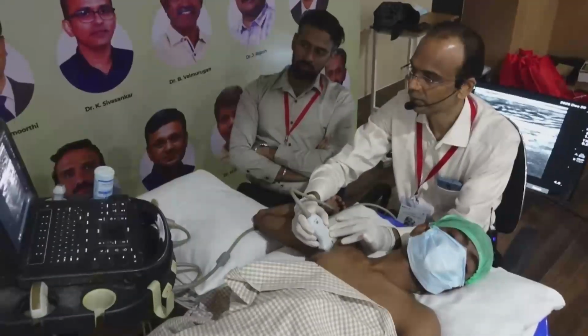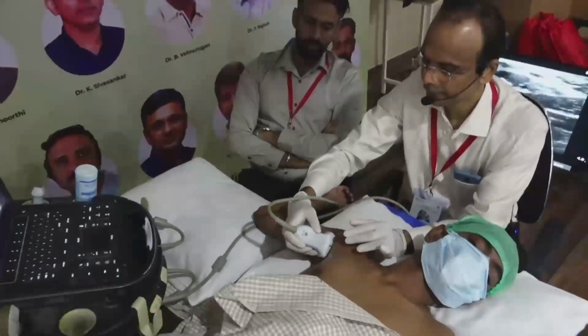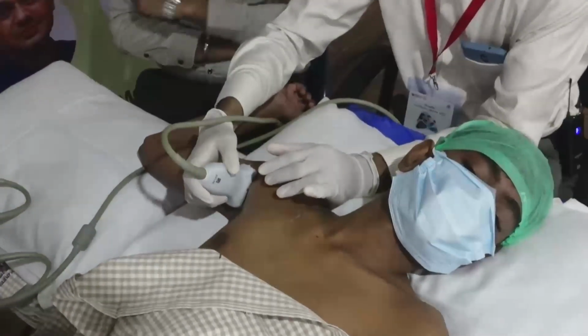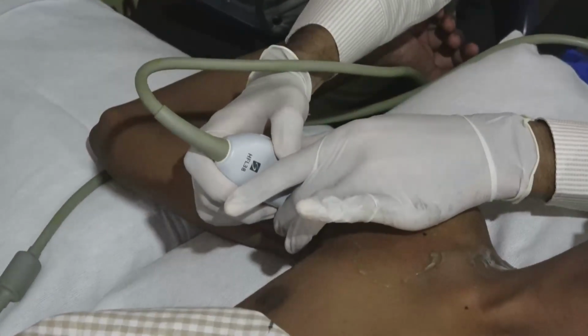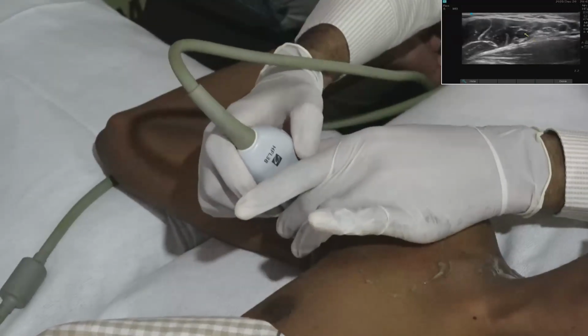The cords, we are following along with the vessels. Now we have to look for the axillary vessels. So depth we can reduce. You can see one pulsating artery. Here also plenty of anatomical variations are possible.